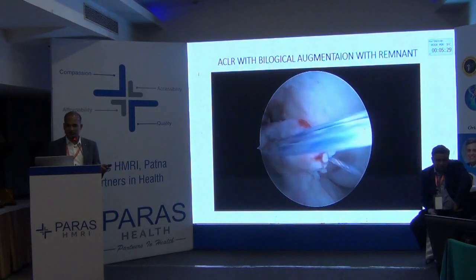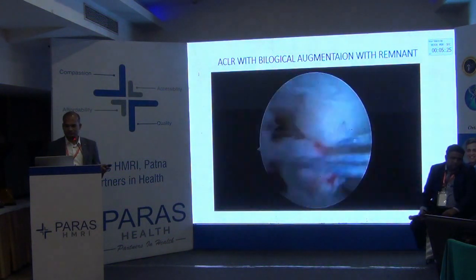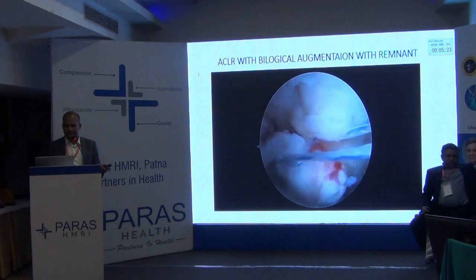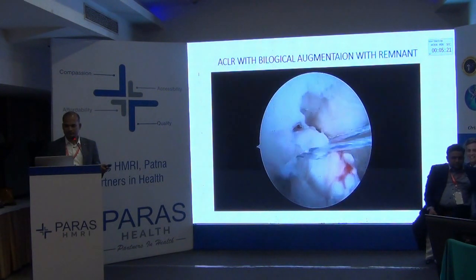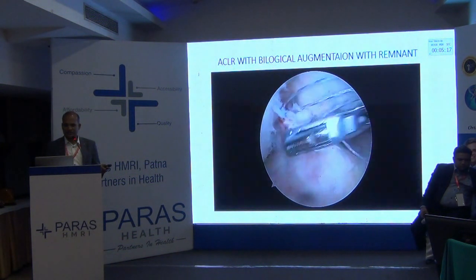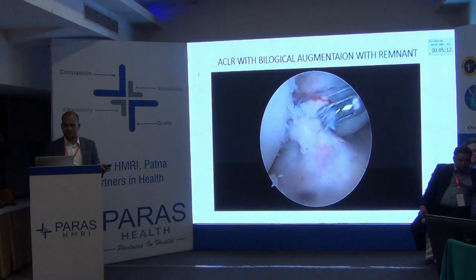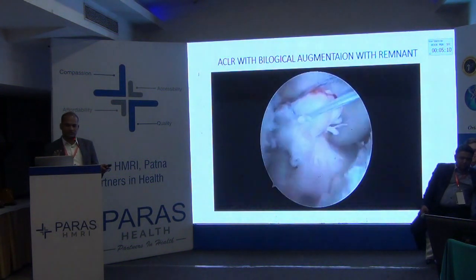So one bite is here, and this is another bite. This is before passing your graft.